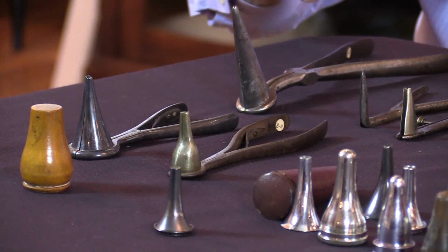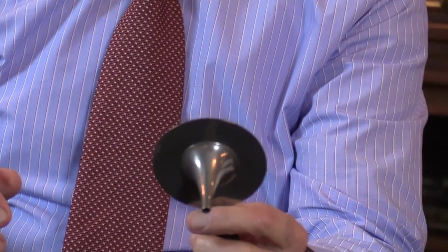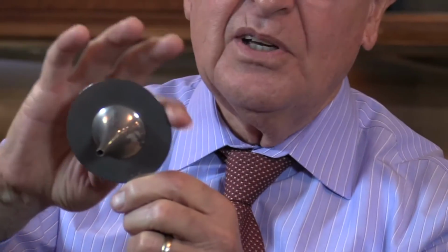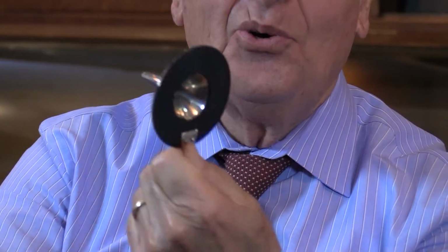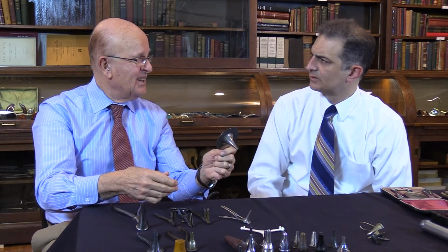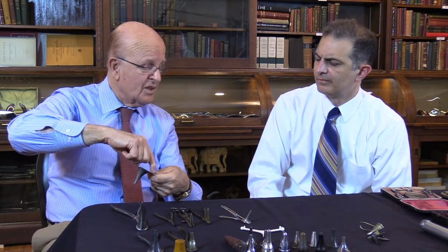There's something of interest, Joe. I've never seen anything like this before. Just one time I found this on an auction, that they have a diaphragm here, apparently so the examiner does not get exposed to pus coming out, or I don't know why they had this kind of it may even be to block light out. Or block peripheral light. Yes, exactly. Yeah, you're right, Joe, especially with the black paint around here.